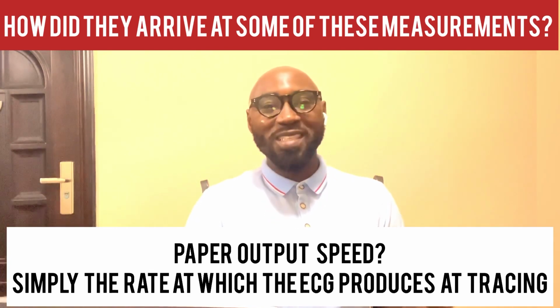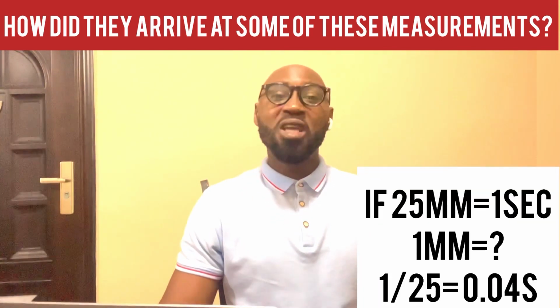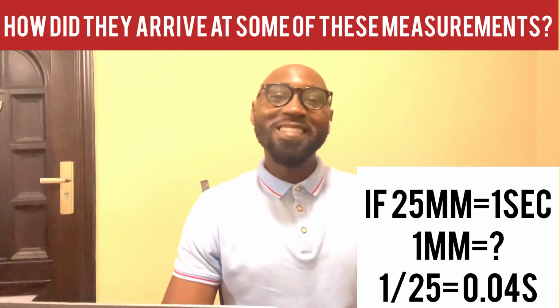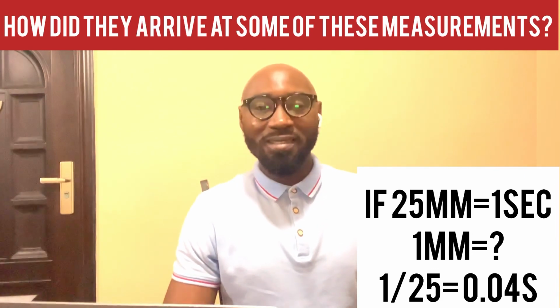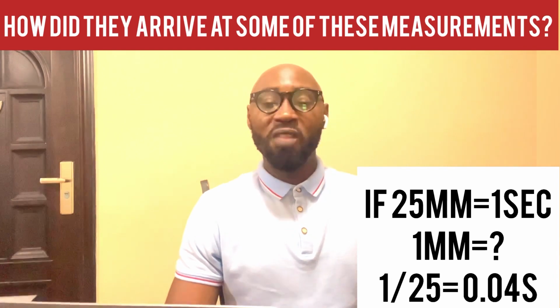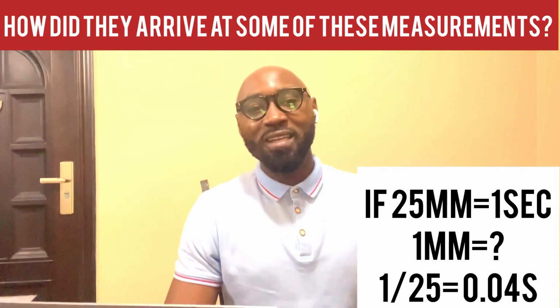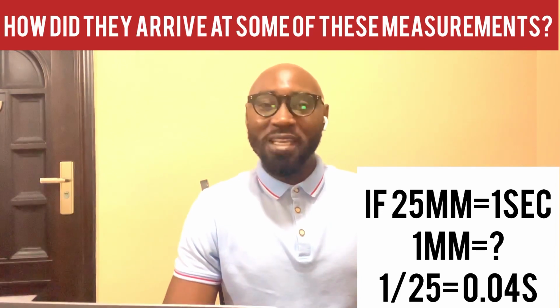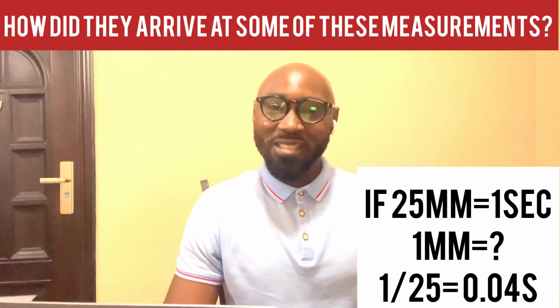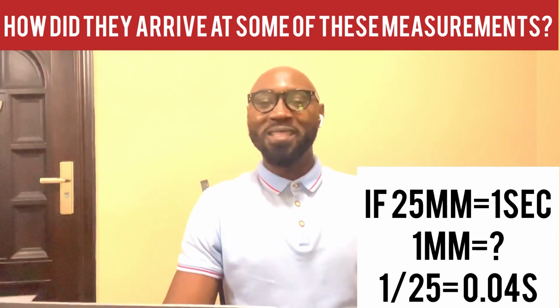So the simple question here is: if within 1 second the ECG tracing, that's the standard, covers 25 millimeters, then how many fractions of a second would it take for the ECG to produce a tracing on one small square that measures 1 millimeter?